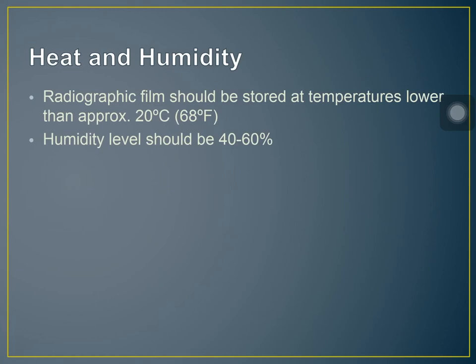Okay, so doon tayo sa heat and humidity. Kung naaalala, from our first topic, the processing room, I've already said that our film is sensitive. It is sensitive to light, sensitive to radiation, and some sensitive to fog or to heat. Because of its sensitivity, once na na-expose yung film natin unexpectedly, it can cause fog.